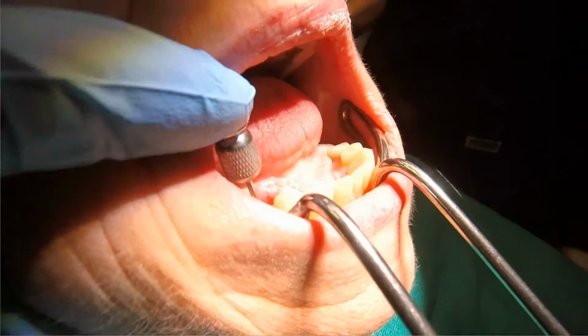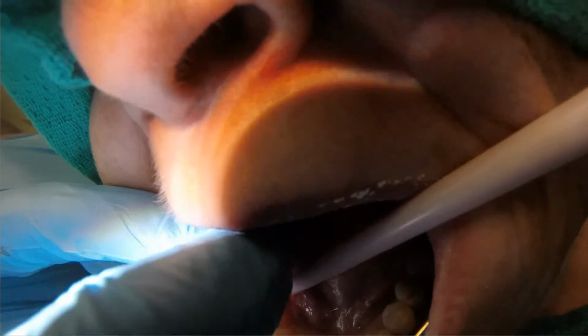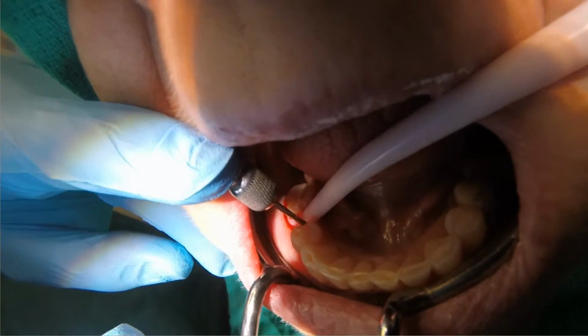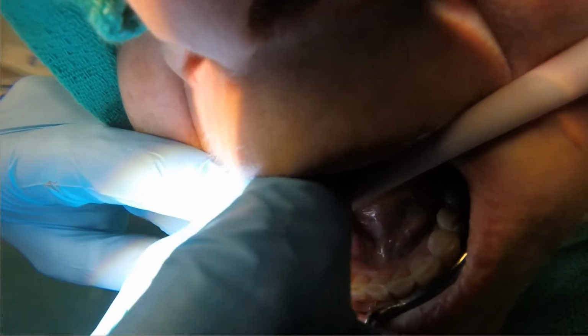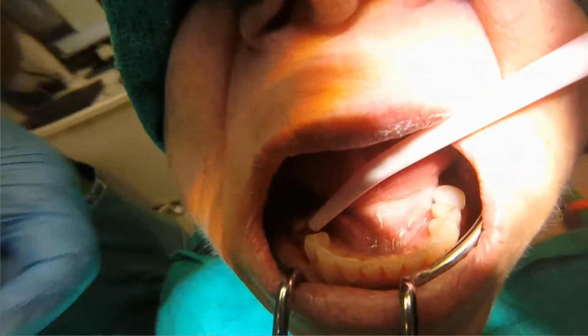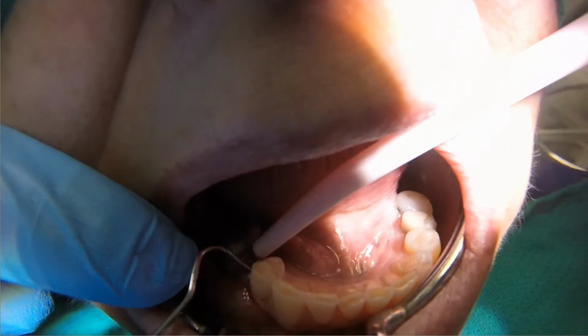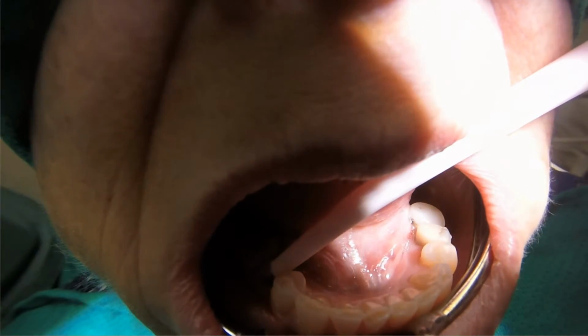So now that we've got the tissue reflected, what we've done now is we've taken our 1.25 millimeter hex screwdriver. You've got to be careful to keep a finger on this so that it does not fall into the back of the patient's mouth, and basically just counter torquing the cover screw off. And there's still some tissue here, so I'm using an explorer just to help relieve some of that tissue.